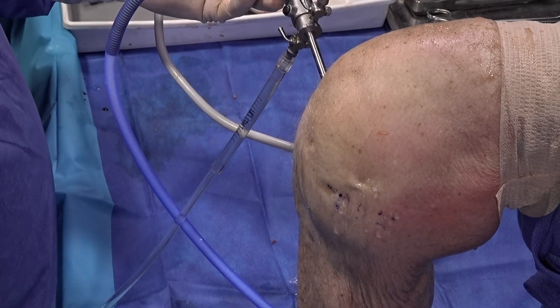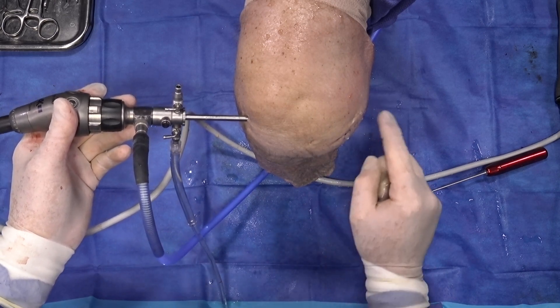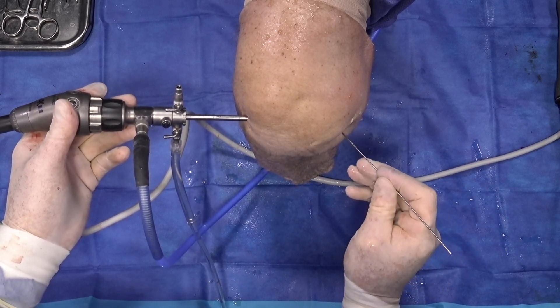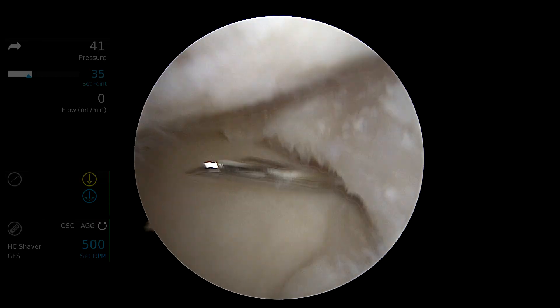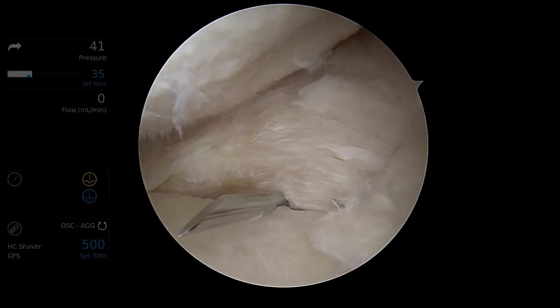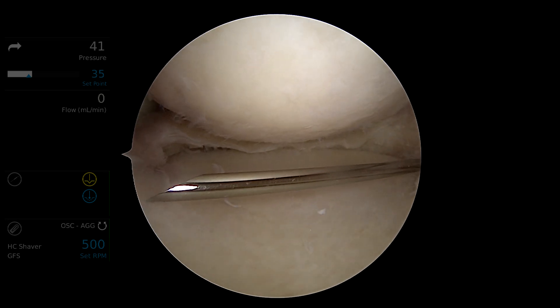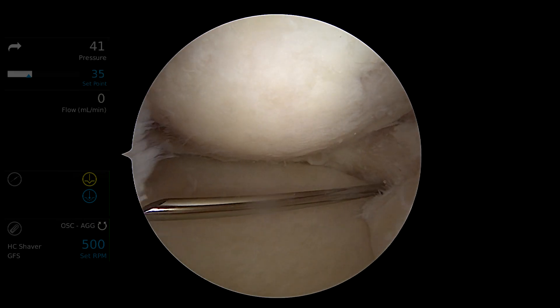We are then going to place our guide pins relevant to the anterior and posterior extents of our meniscotibial ligament insufficiency. These guide pins come in the kit. I typically start at the anterior aspect — the pins come in just below the inferior surface of the medial meniscus and parallel to the tibial plateau articular surface. When we get to drilling, we want the guide pin to point right at the base of the ACL, or the tibial spine.